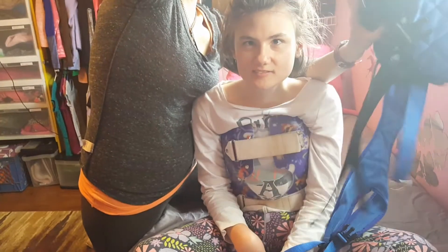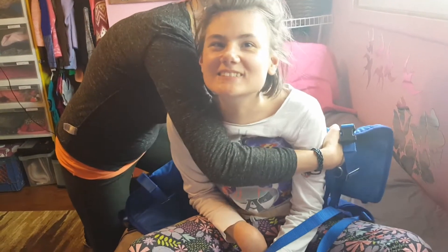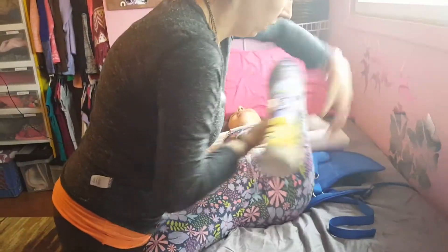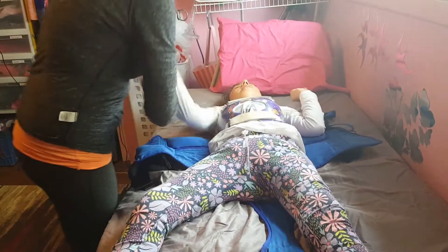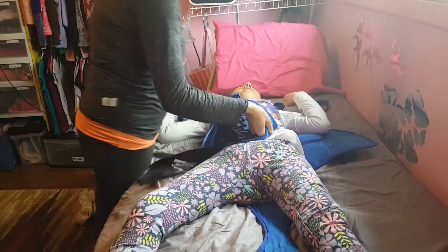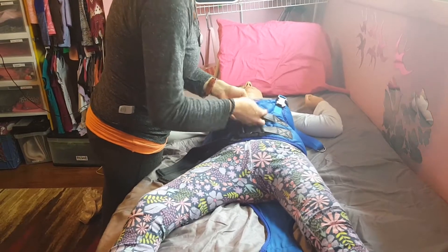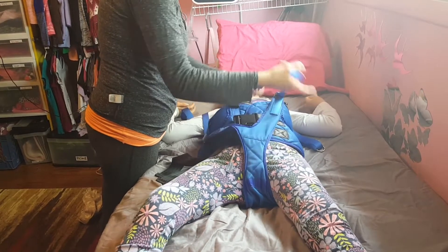This is her walking harness. You're going to go ahead and snake that around her body. Kind of just leave the crotch part down there by her butt. Go ahead and let her down. Going to pull the crotch part down. You want to get her as lined up as you can. Get all your straps up top and then clip her in. We still have her G-tube here so that we're not going to get behind on fluids or anything like that.